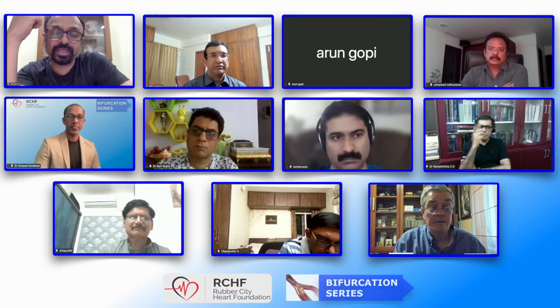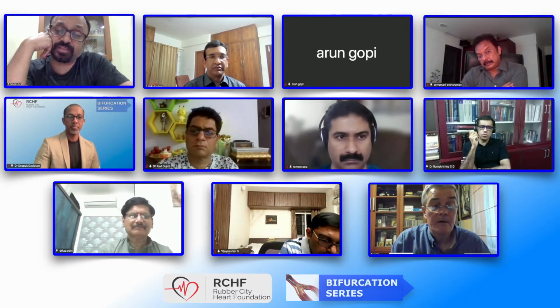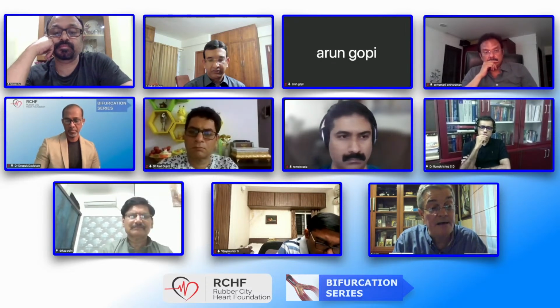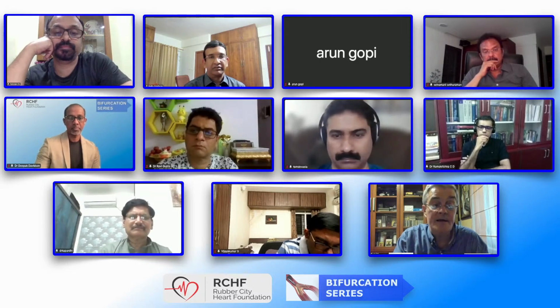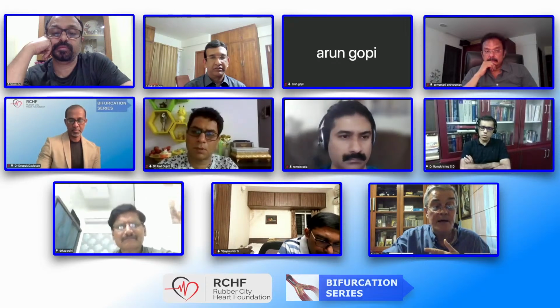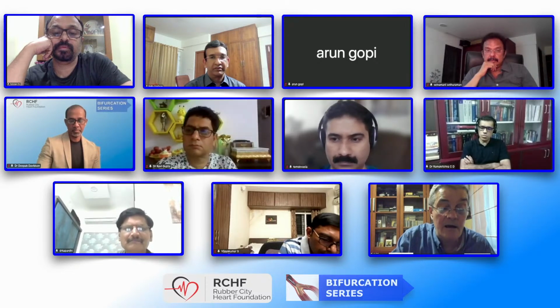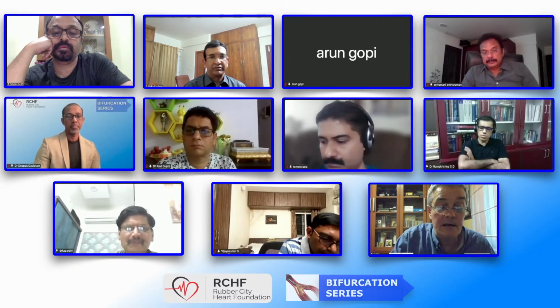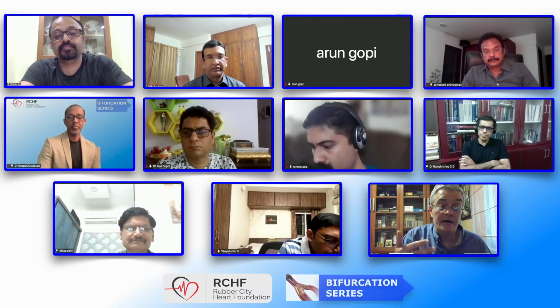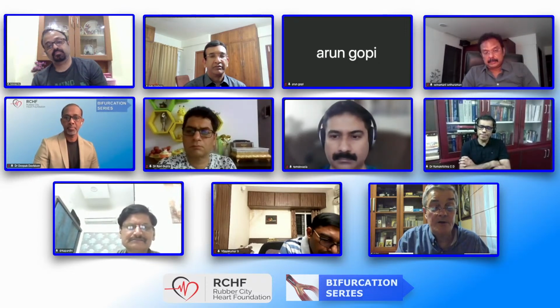I was talking about mini crush where there is a final kiss that is accomplished. If it's accomplished, I don't see any reason to expect a difference in clinical outcome. But the problem is that the rate depends, of course, from study to study. With mini crush, for example, in the earlier series, you had only 80% or even less of the final kissing. And this dramatic reduction in the final kiss is probably the reason that people negatively speak about mini crush.